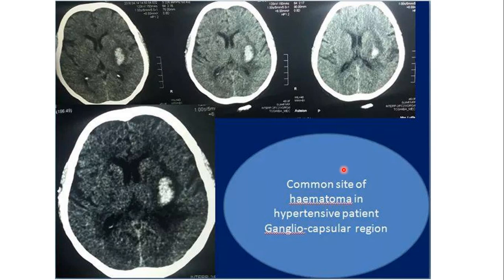The common sites of intraparenchymal hematoma are mainly the gangliocapsular region due to rupture of small perforators, particularly the lenticulostriate artery. You can see examples here at the basal ganglia distribution — different cases, all at the basal ganglia — and these are mostly due to hypertensive stroke.